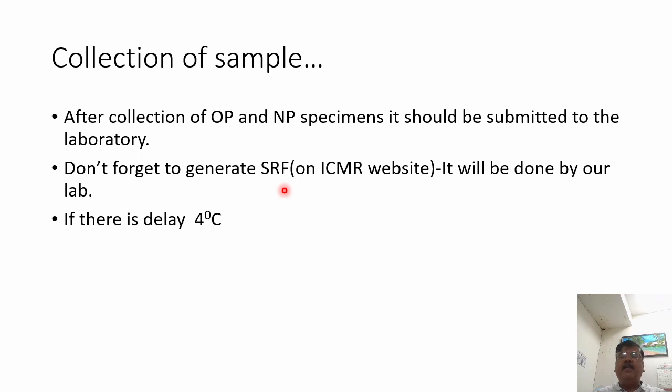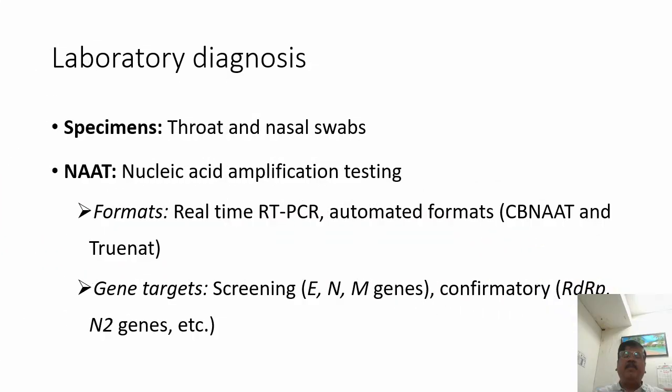Don't forget to generate the SRF. Again, I am repeating this. On the ICMR website, as per the government guidelines, it will be done by our lab. If there is a delay, 4 degrees Celsius temperature preservation is important. Otherwise, the attempt will be futile. So throat swab, nasal swabs.